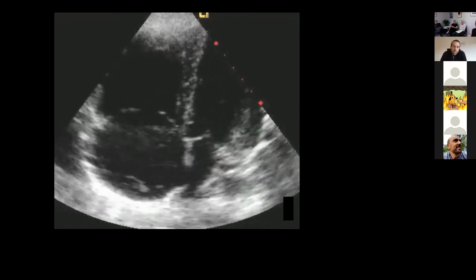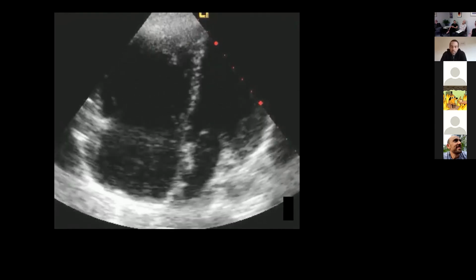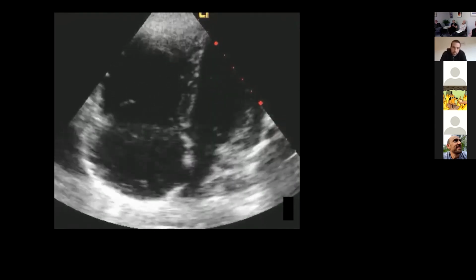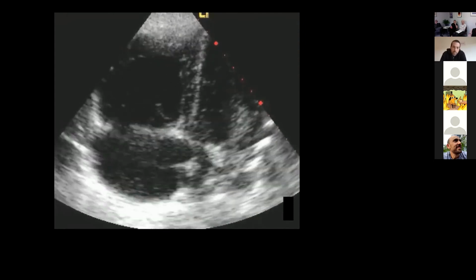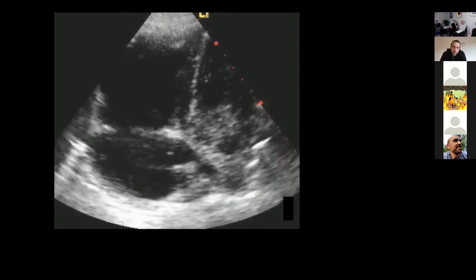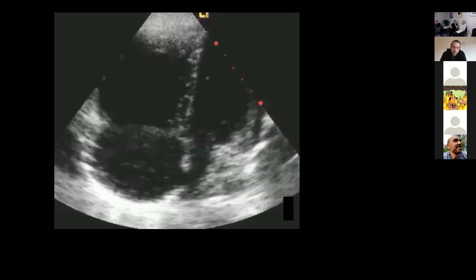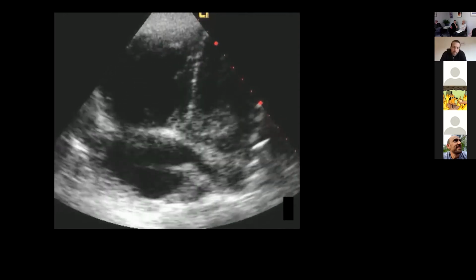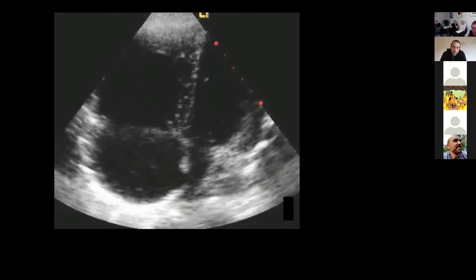You can see, and it's another instance, it shows a lot of things. One is that the right chambers can dilate up within half an hour. You've lost your right ventricular contraction virtually. You can see how you squash the left side out of existence. And unfortunately, despite all their efforts, this woman just was not able to be resuscitated. So amniotic fluid embolus, we fear it.